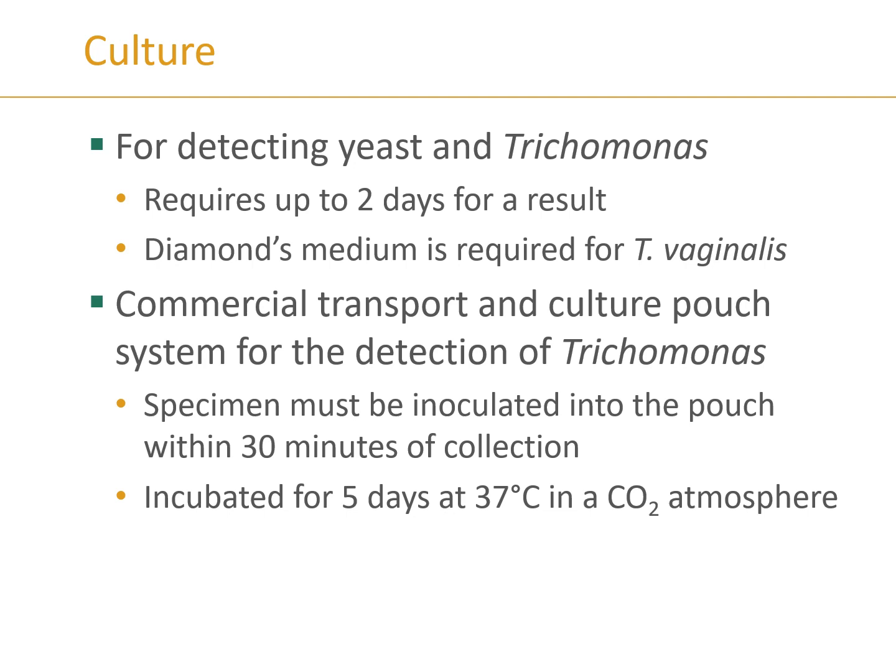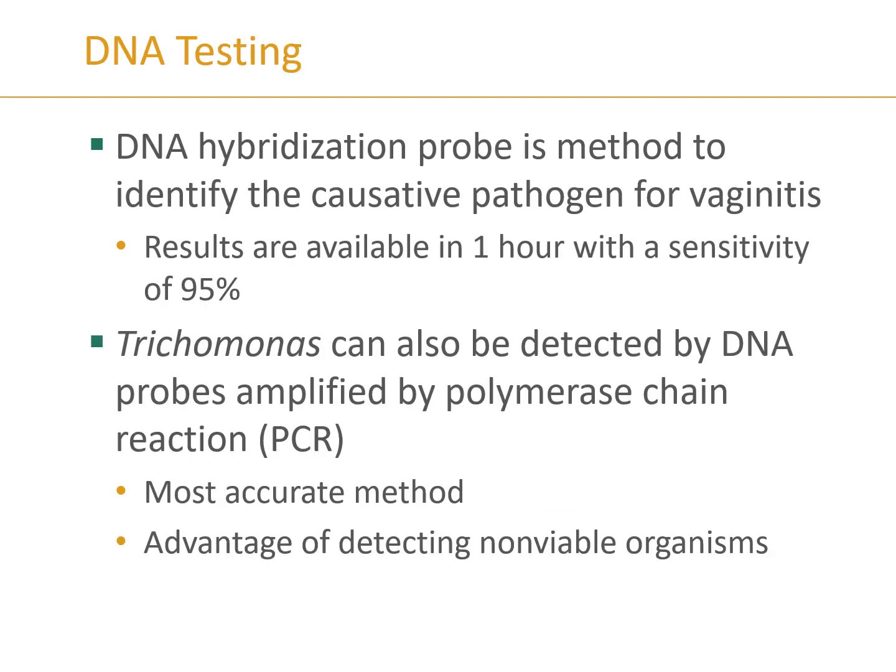There are various commercial transport systems that help to preserve Trichomonas for some of the culture methods, but I don't know that many places culture for Trichomonas anymore. As technology advances, we're seeing more of this switching over to automation.